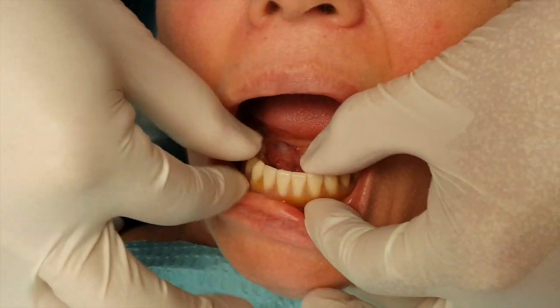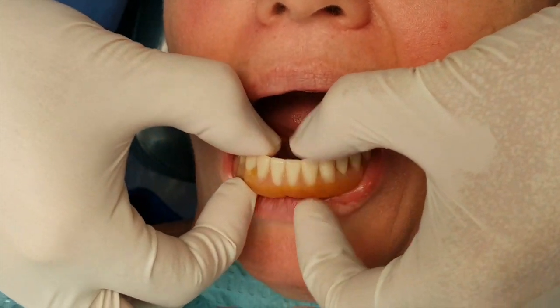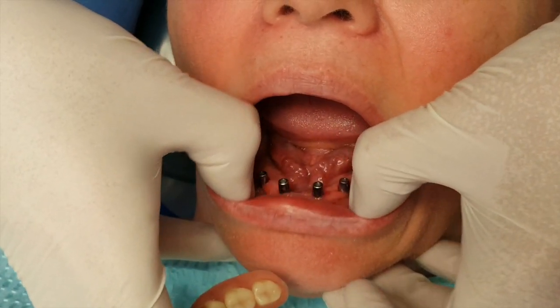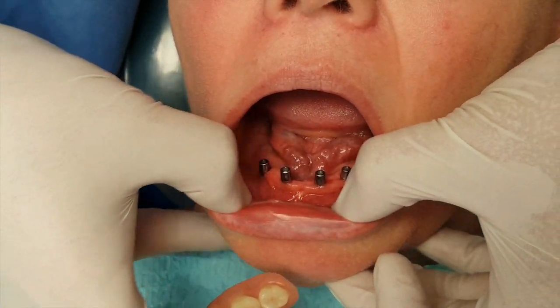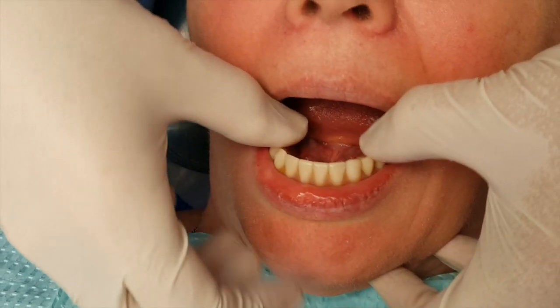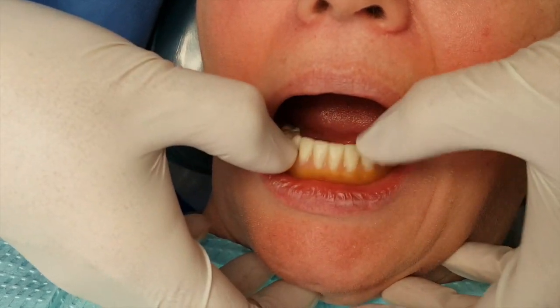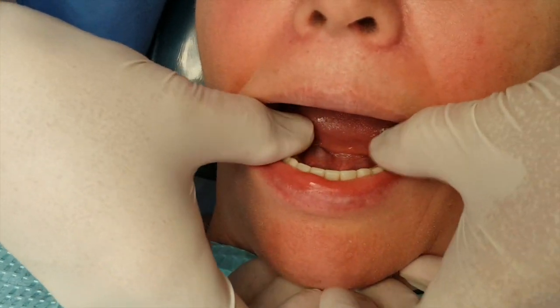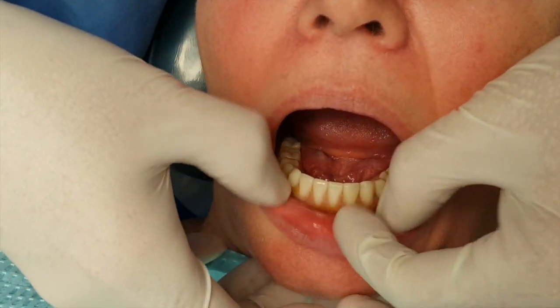I'm going to remove the denture — there we go, that's pretty tight. Let's put this back in, but before that, let's show how these implants are looking. Should drop in rather than that — there we go, it's going in.